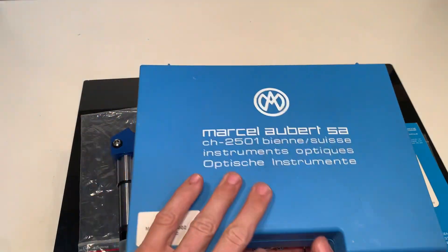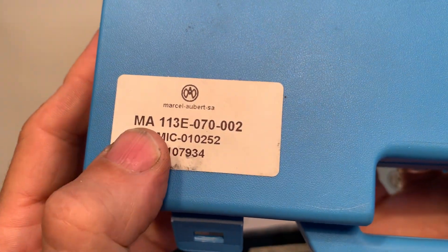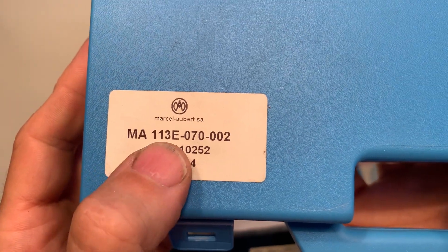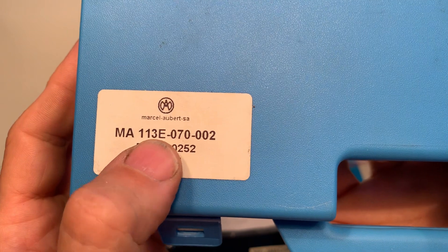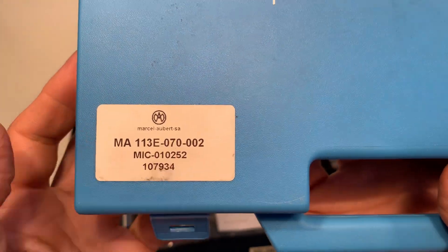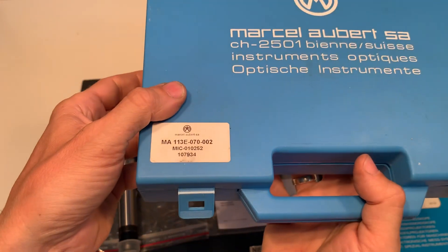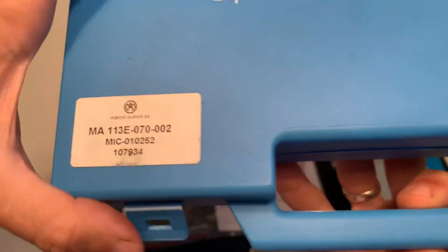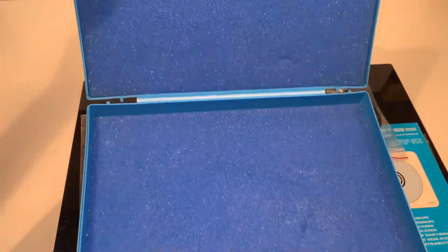It comes in the box and this is the number here. The 'MA' is probably standing for Marcel Aubert, 113E. The 'E' is standing for the integrated light. The rest of the serial number I don't know — probably something about the size.